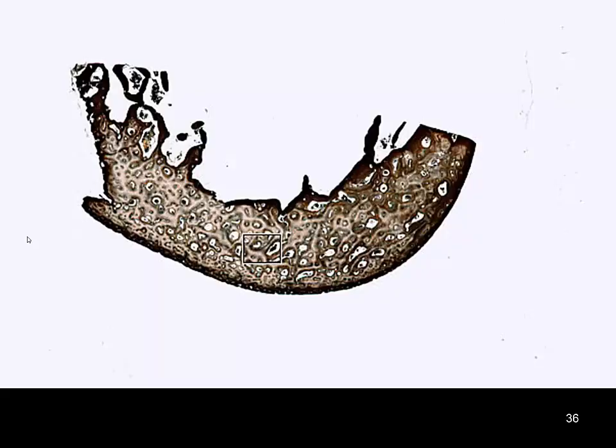Now, often when you look at bone, it's going to be demineralized bone. And this particular image is going to be just that. They have demineralized, tried to remove the calcium phosphate matrix. And so they've stained this with a silver type stain to try to stain the plasma membranes of cells. And that's what's going to give it this brownish type color.